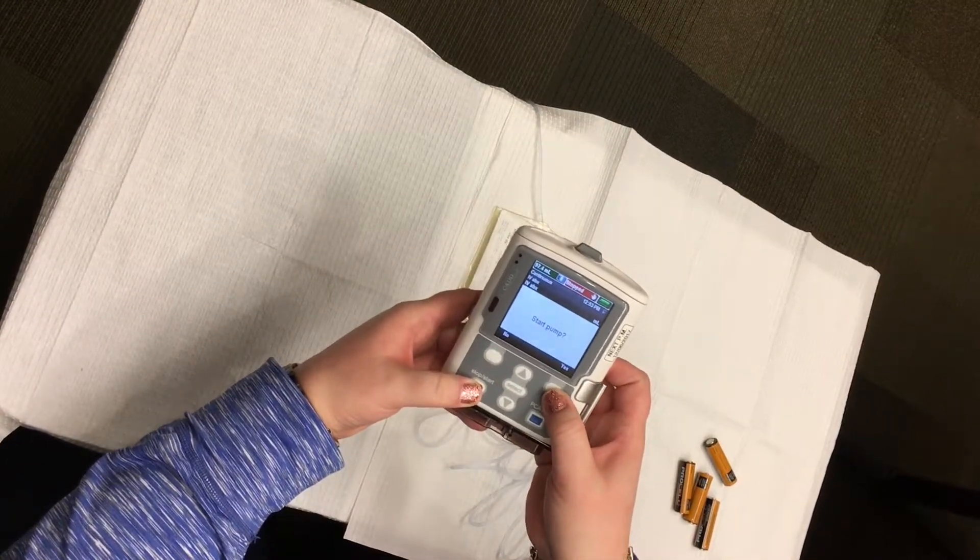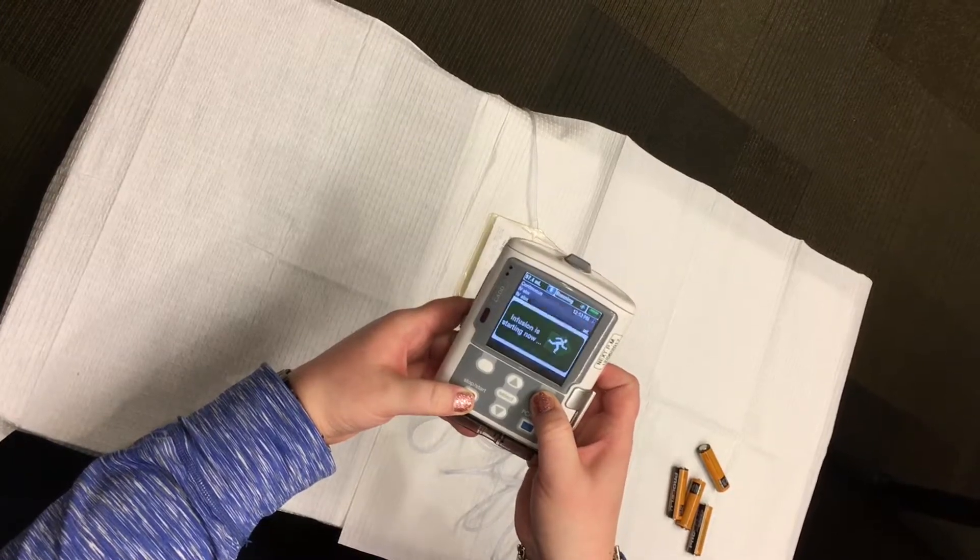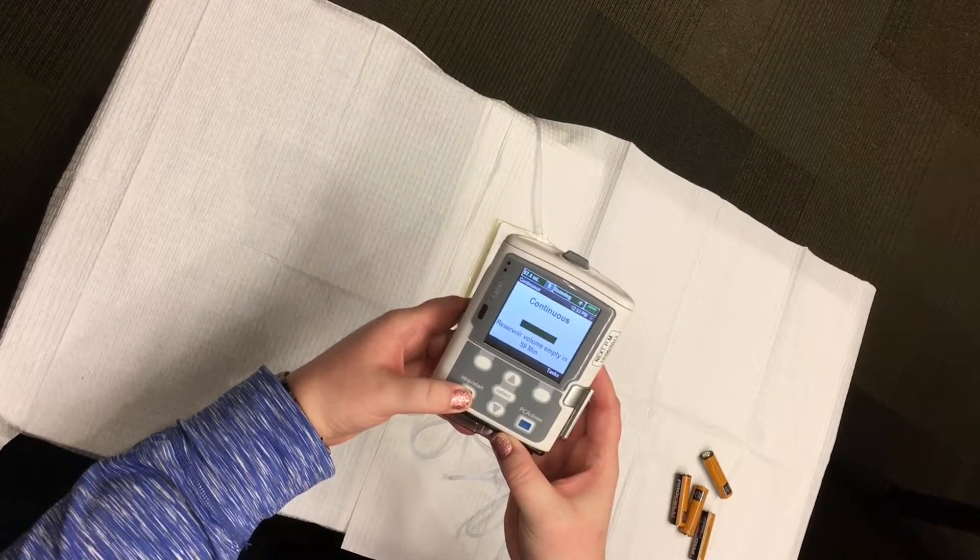When the display says 'start pump,' press the white button below yes. Your infusion will start from the point where it was interrupted.